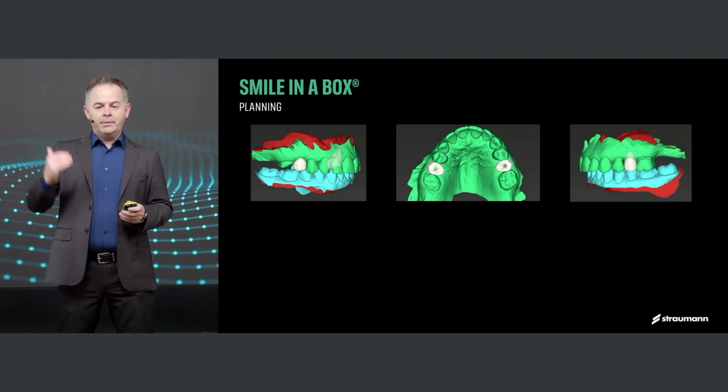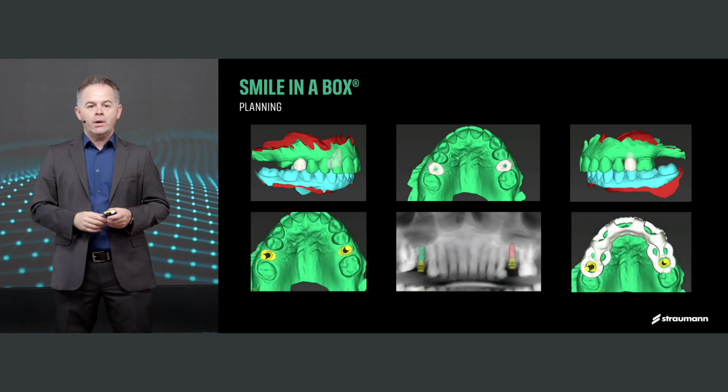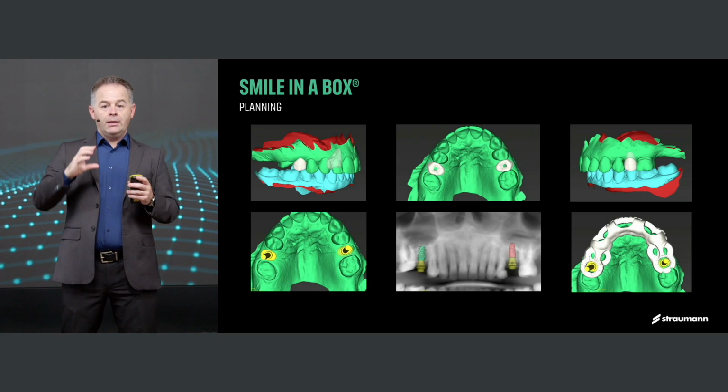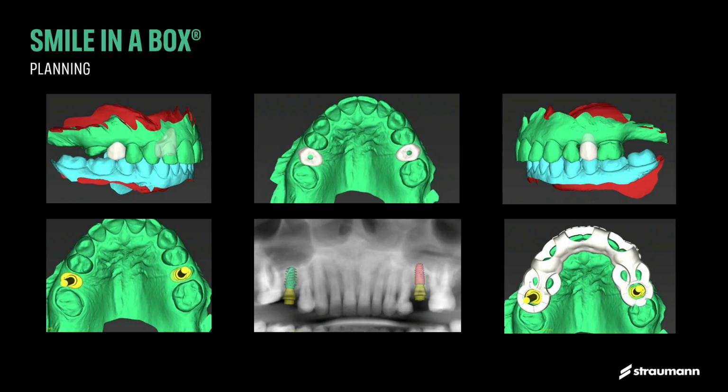They always start from the top-down planning, so they see what will be the correct prosthetic position that will best match this patient condition. Once you have sorted that need, then you go one step lower and you start allocating how the implant is going to be positioned, what the implant diameters are going to be possible to be used. And also you see on the left already, including in the planning, the anatomic healing abutment of choice, because those two implants are going to be placed and the anatomic healing abutment we're planning to insert in there. So this patient goes for healing without having to be temporized with all the push and pull of the tissue later.